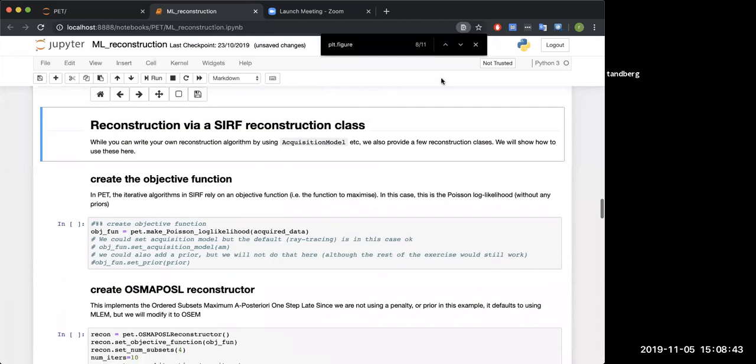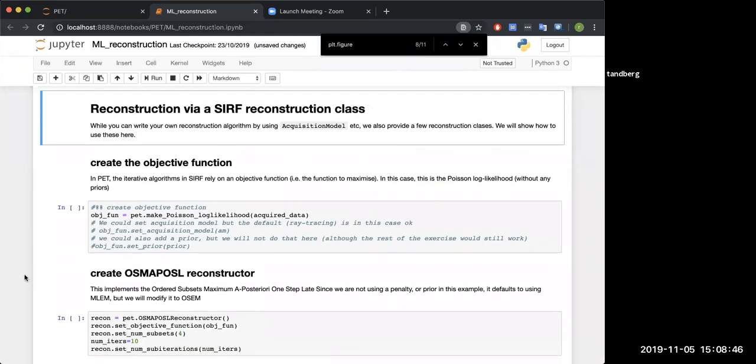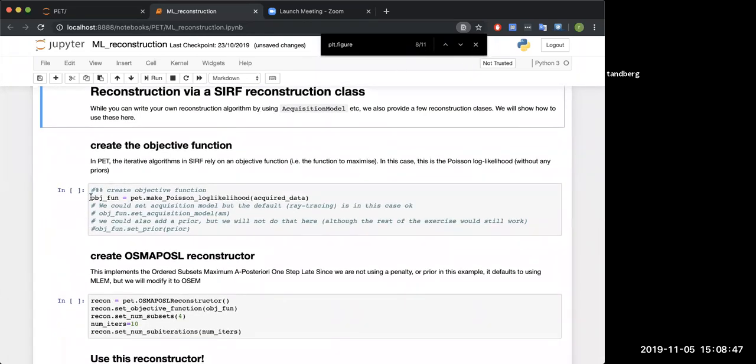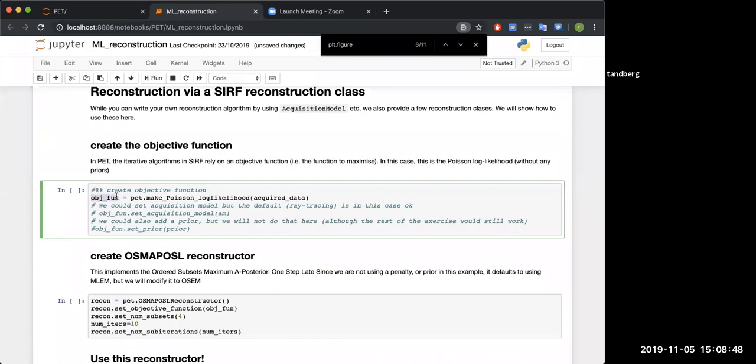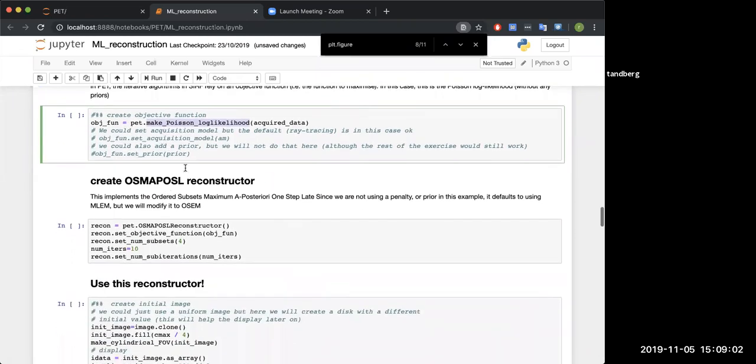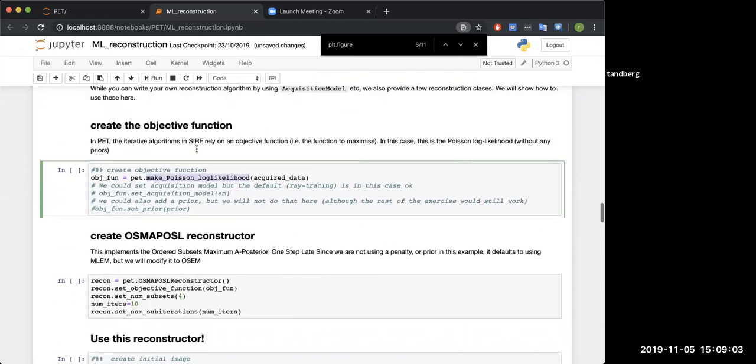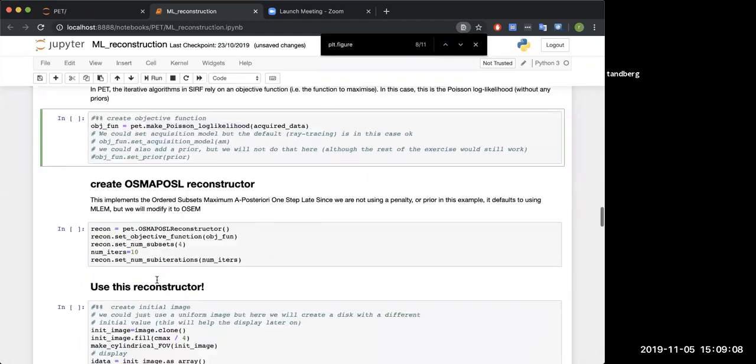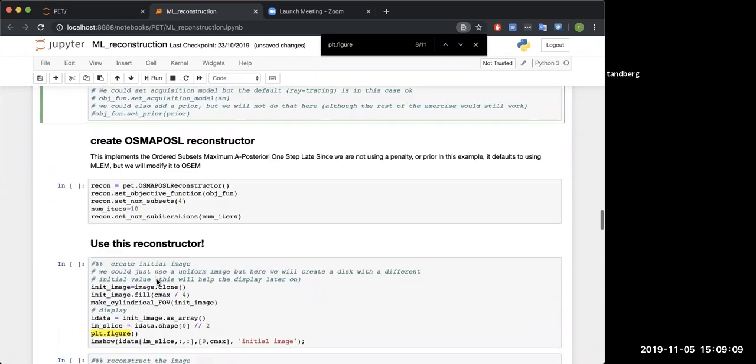Create our new acquisition model. This we've seen 100 times, so we're perfectly happy with everything that's going on here. It needs a template sinogram, so we'll do that. Forward project the data, and now we've got a new sinogram, an acquisition array. Let's have a look and see what that looks like.